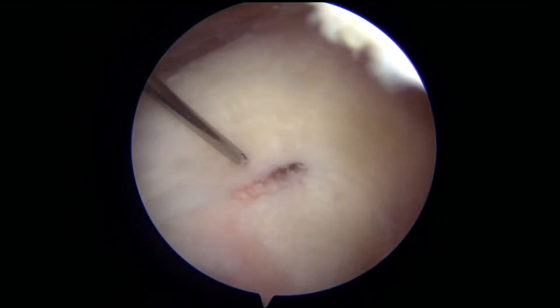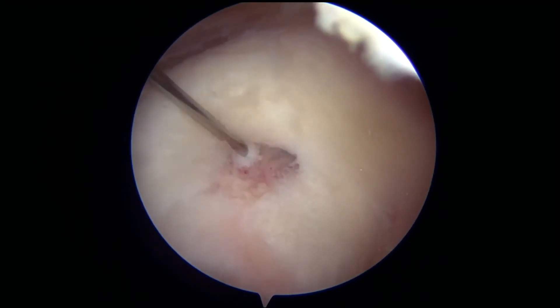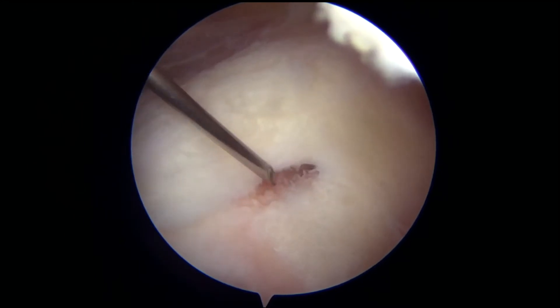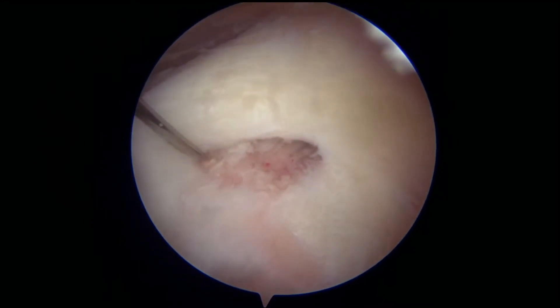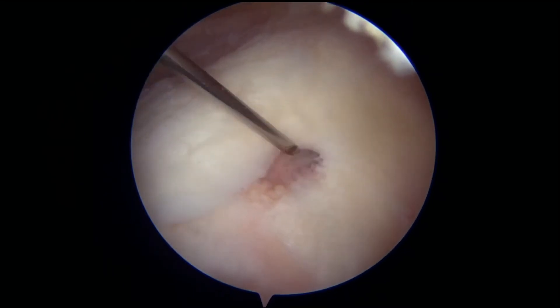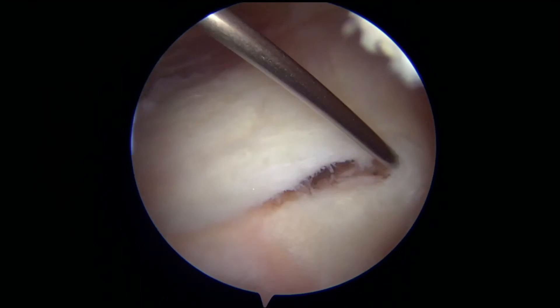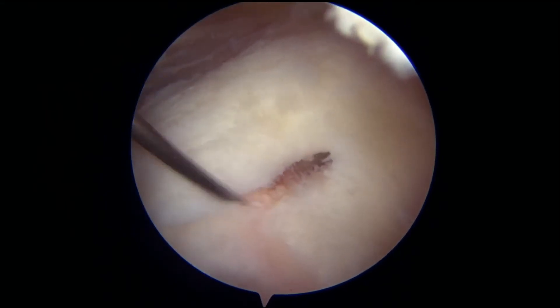The next portion of the procedure is to evaluate the size of the tear. This is a view of the supraspinatus tendon, which lies just below the bone spur that we were just removing. I'm probing it with a spinal needle. It's approximately 15 to 20 millimeters in length, which is about the size of a nickel or a quarter. And so this would be considered a small tear.